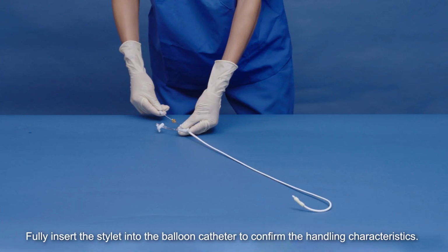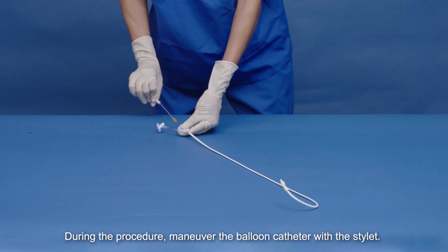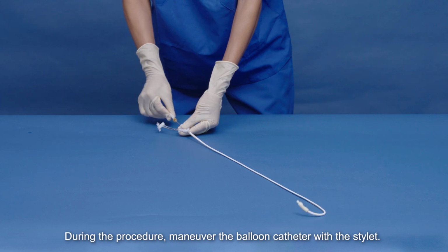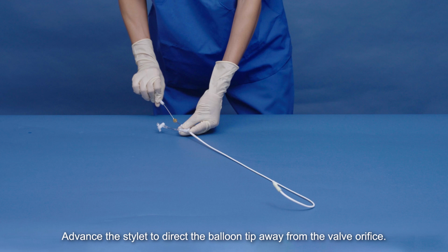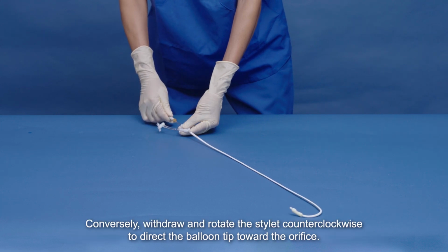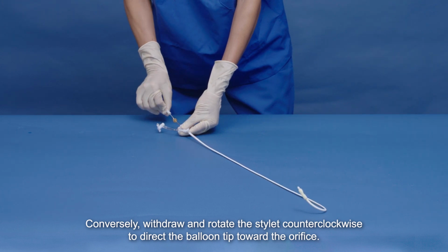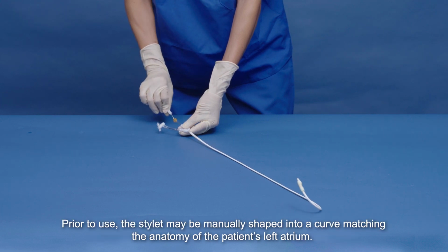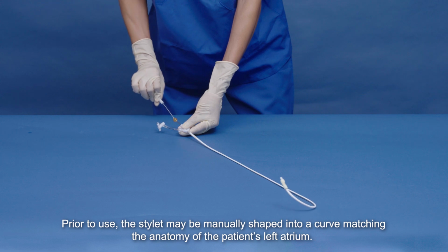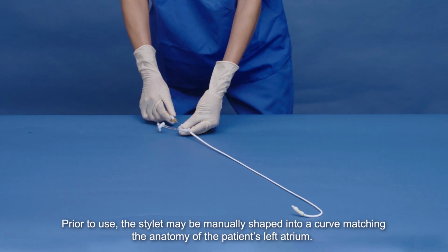Fully insert the stylet into the balloon catheter to confirm the handling characteristics. During the procedure, maneuver the balloon catheter with the stylet. Advance the stylet to direct the balloon tip away from the valve orifice. Conversely, withdraw and rotate the stylet counterclockwise to direct the balloon tip toward the orifice. Withdraw and remove the stylet from the balloon catheter. Prior to use, the stylet may be manually shaped into a curve matching the anatomy of the patient's left atrium.